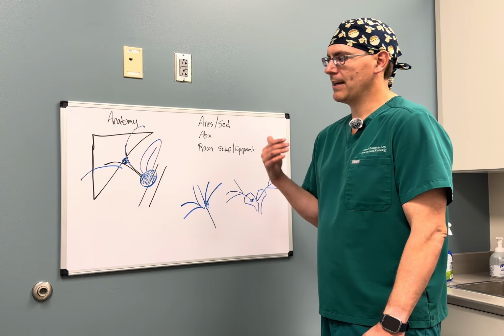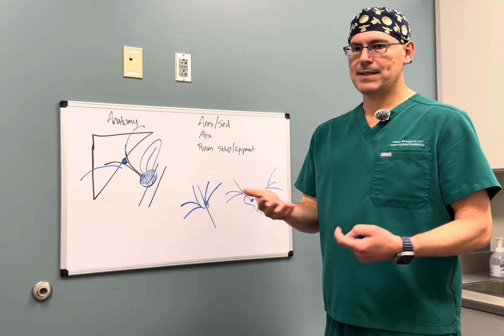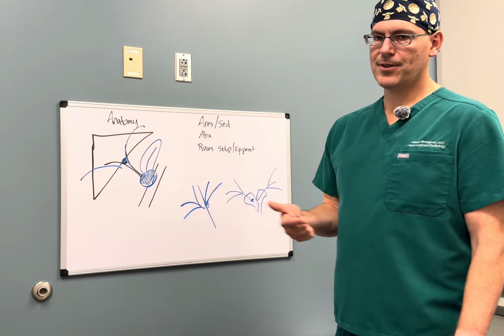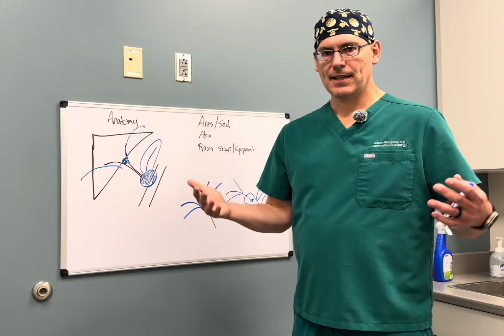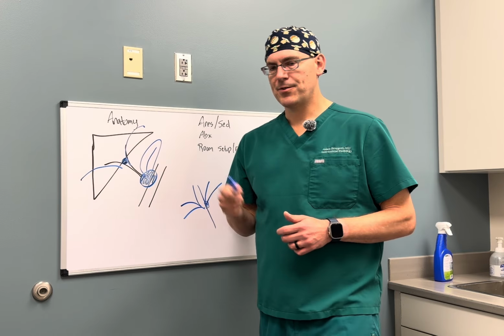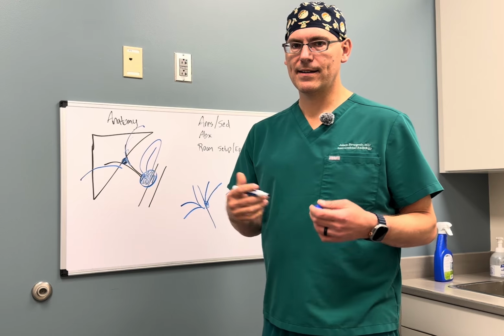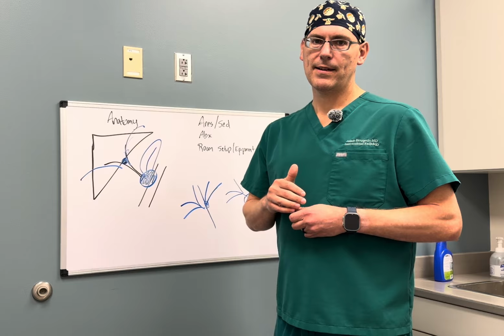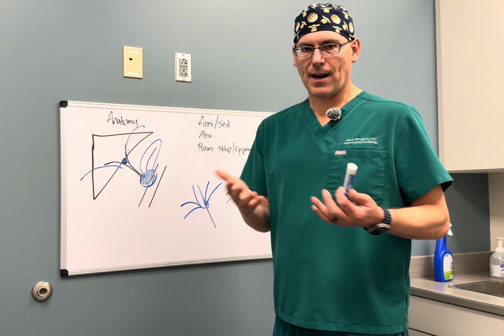Regardless of what we're planning eventually in this situation, we tend to put bilateral drains, and then we get a biopsy at the same time typically. And so for this, when we're placing two drains, anesthesia is helpful. These patients go to sleep because there are a lot of moving parts. Occasionally, if we have a unique situation, like a metastasis just blocking up the left side and very dilated ducts, then we'll do that case with sedation. But as a rule of thumb, these cases are more or less always with anesthesia in our practice.